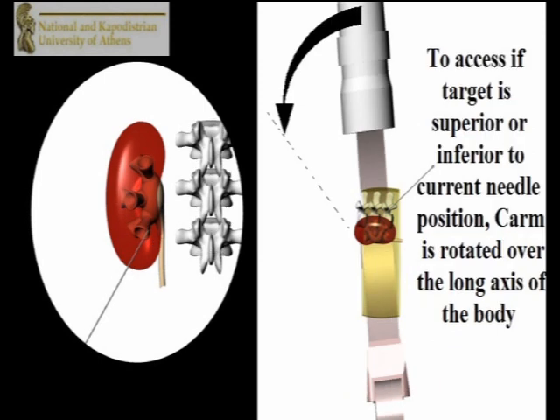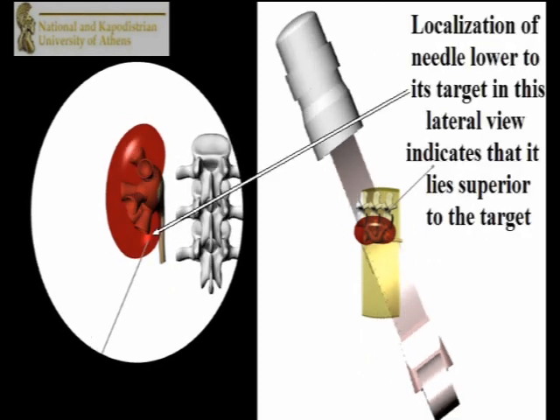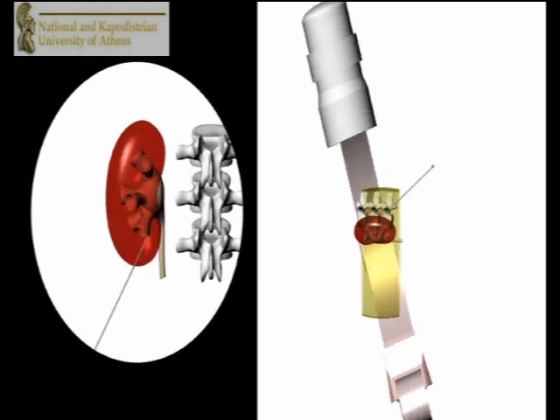The C-arm image intensifier is repositioned 30 degrees from the vertical position towards the head for an oblique view. This gives a side view of the needle rather than a view from above.